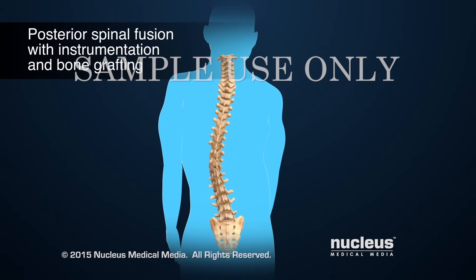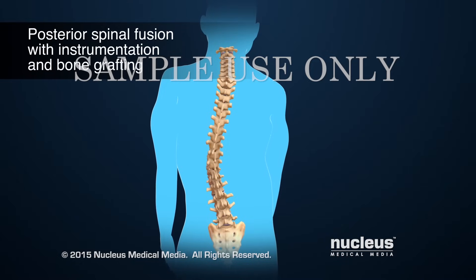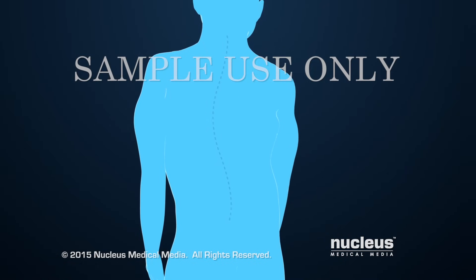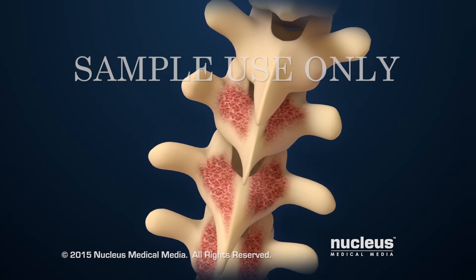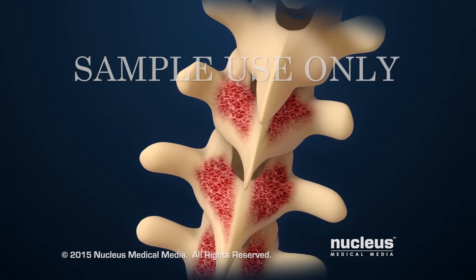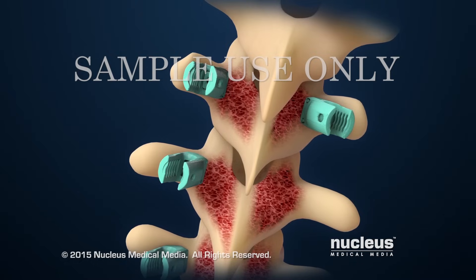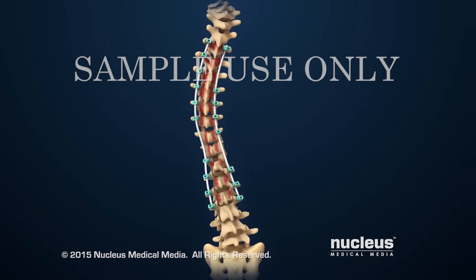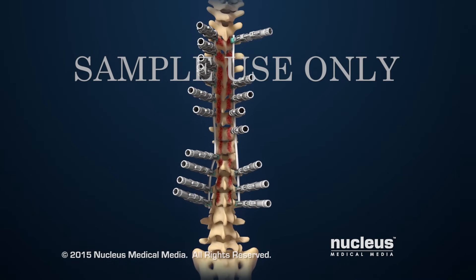The most common surgical procedure to repair scoliosis is called posterior spinal fusion with instrumentation and bone grafting. The surgeon will make an opening over the area of the curve in the spine. The surfaces of the vertebrae will be roughened to help stimulate the bones to heal together. The surgeon will place screws, hooks, or wires into the vertebrae. Rods will be placed alongside the vertebrae and attached to the screws, hooks, or wires in order to straighten the spine.